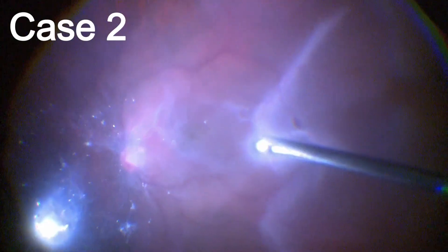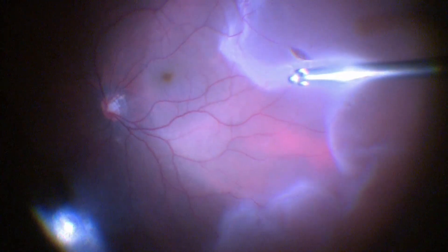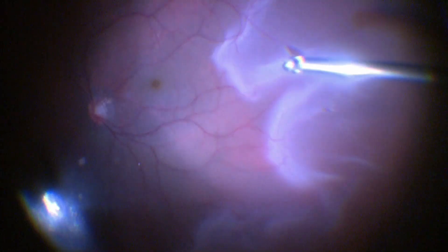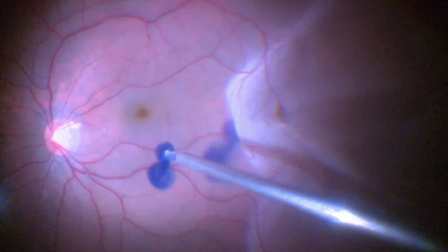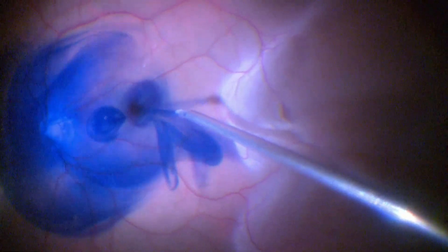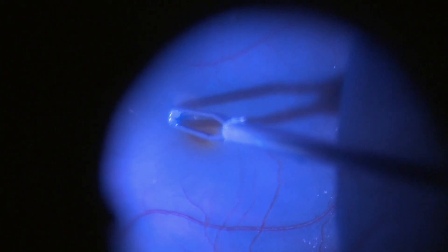In the following case of RD with attached macula with macular hole, vitrectomy was carried out. BBG dye was injected and ILM peeling was done.